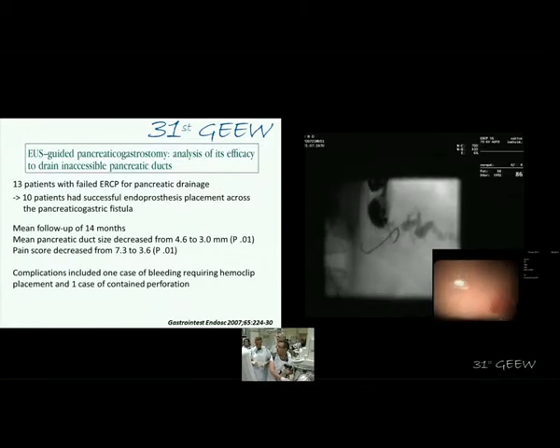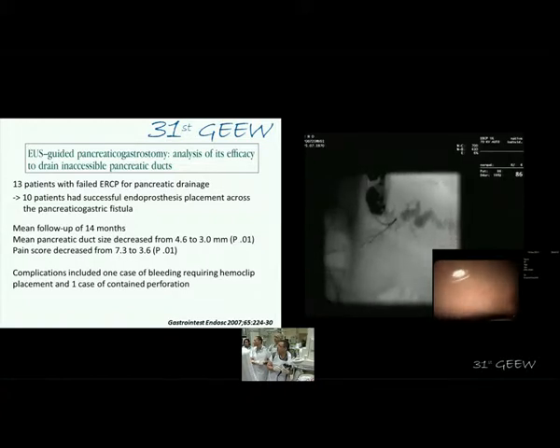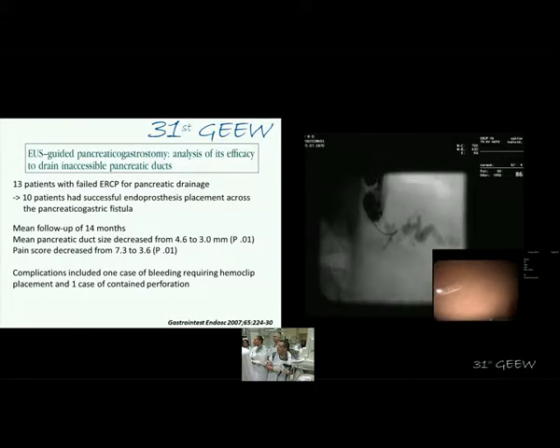You see what happened, Guido? Yes. The wire was going straight to the stenosis, and then when pushing, we did some dilaceration aside the duct. And now the tip of the wire is still in the duct, but it's almost impossible to go back in deeply. But we have a good opacification of the duct, and I'm sure that another puncture will be successful.